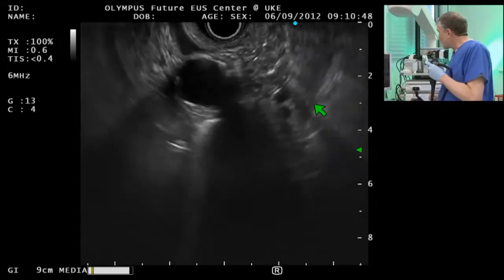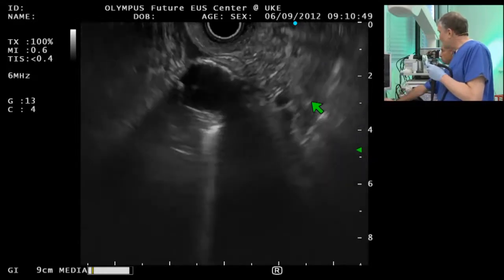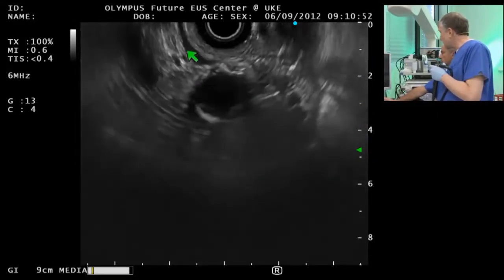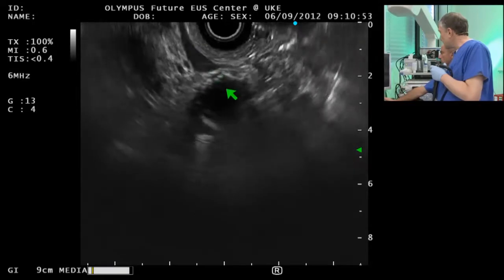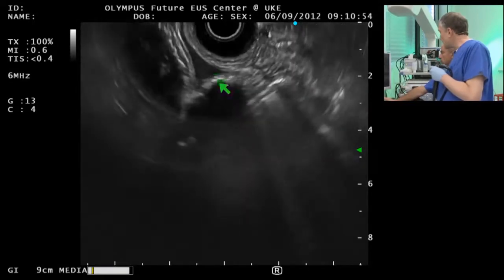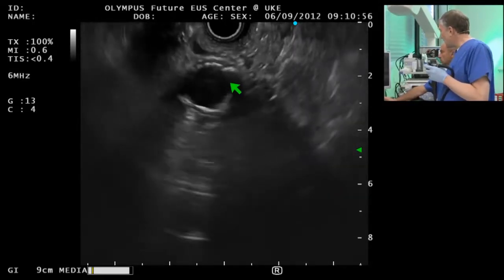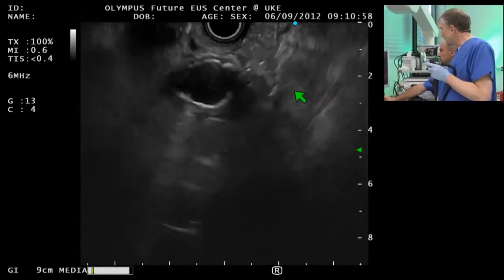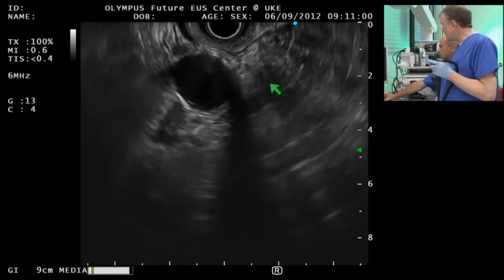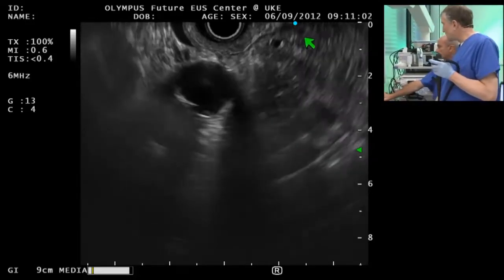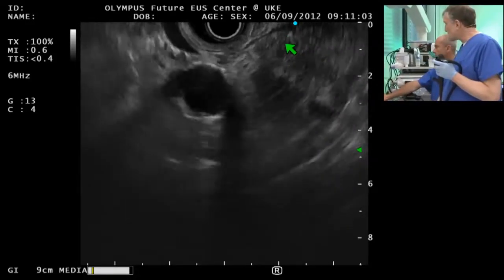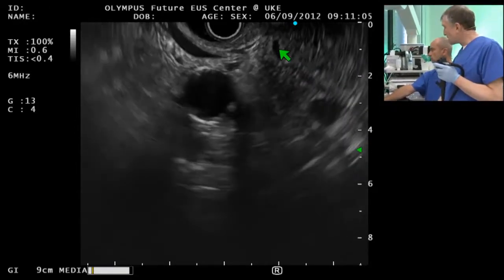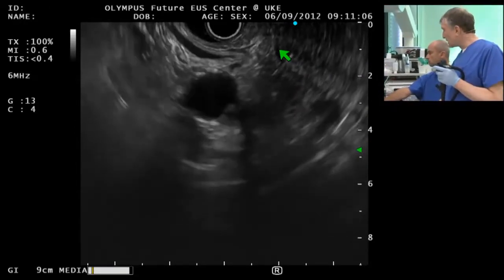We are now in the descending duodenum and we have the big vessels here, the aorta and the cava. Bertrand is kind enough to show it. And I pull back and rotate the scope and here is the pancreas coming into view, the uncinate process. So I pull back, we have the duct, the normal duct in the head.